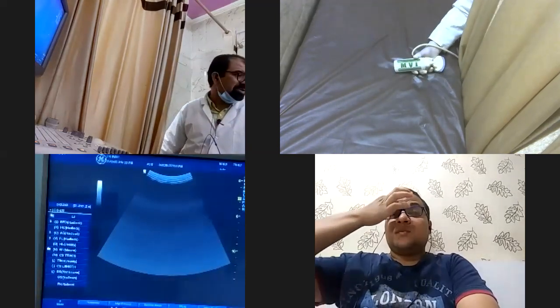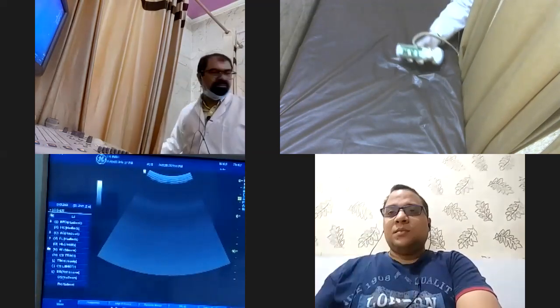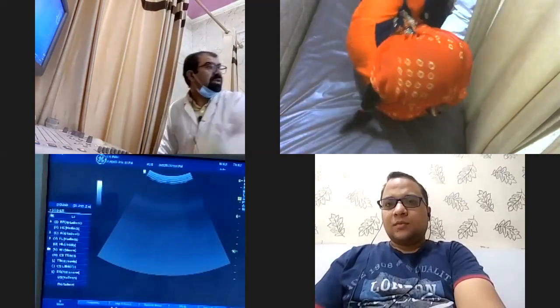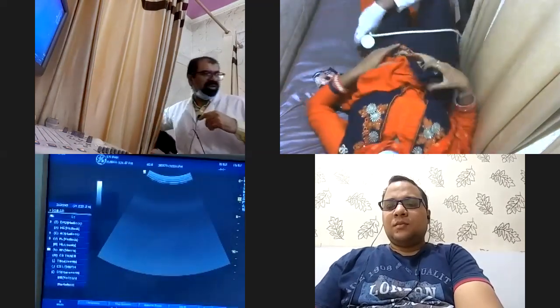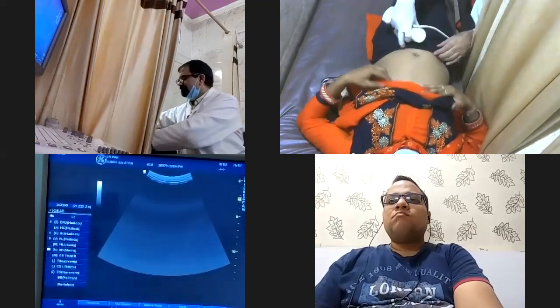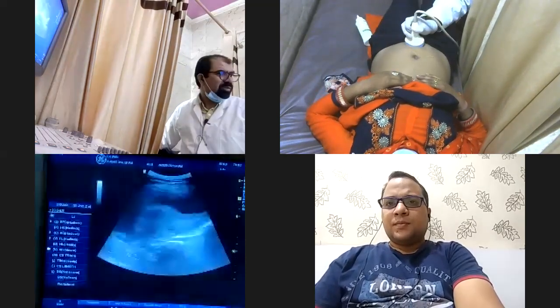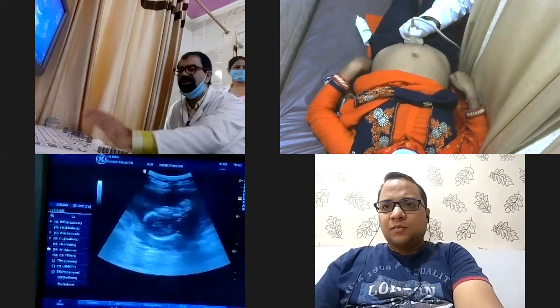Manjit, give the patient. Now see, this is the patient over here. Up, up, down, up. नीचे करो ये. Now see what I am doing. This is transverse. Yes, sir. Yes or no? This is transverse.